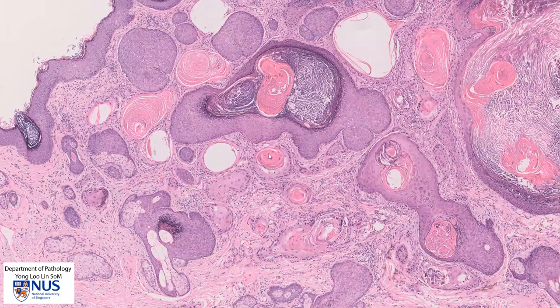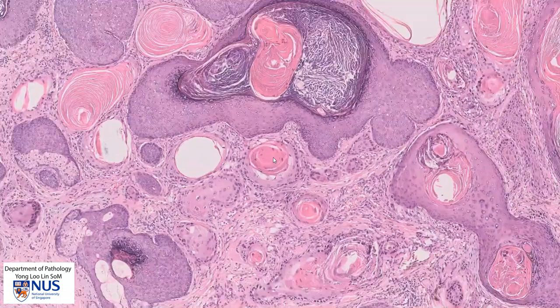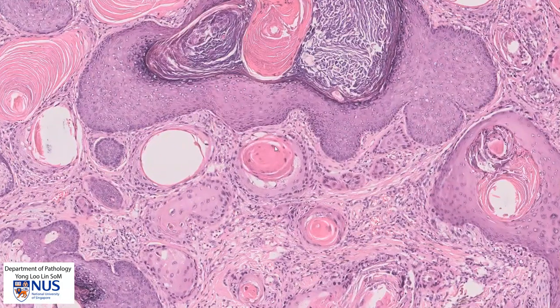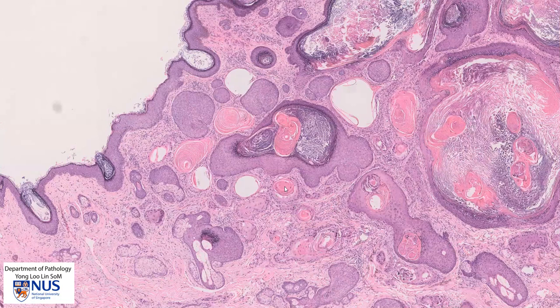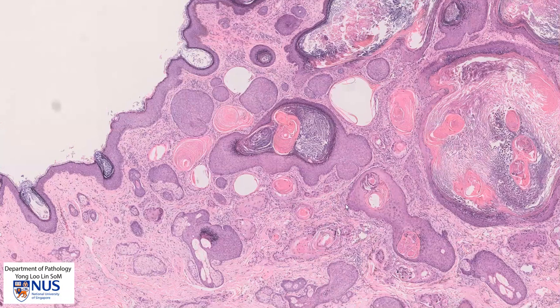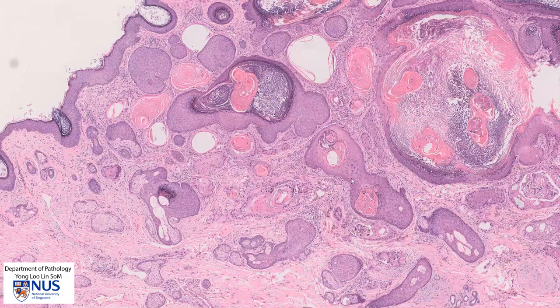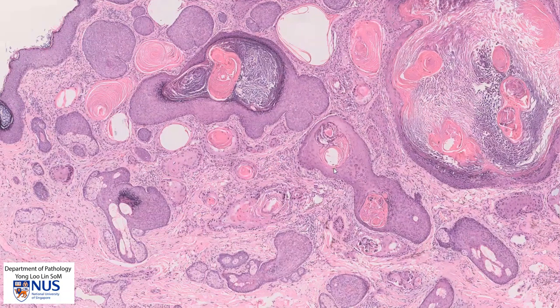You also notice that there are some areas where you see these whirls of densely orangophilic material — these are keratin pearls, and these are characteristically seen in keratinizing squamous cell carcinoma. In general, the more keratin pearls we see, the more well-differentiated the tumor is, but we also have to take into account the degree of nuclear atypia.